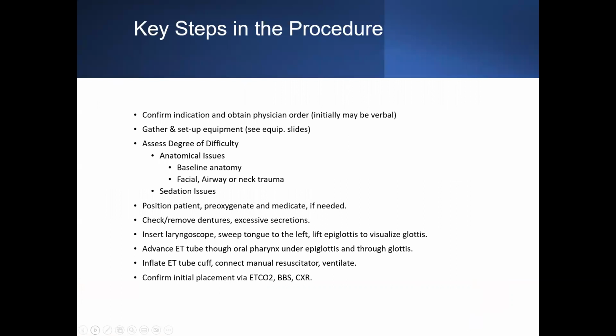Key steps in the procedure, you guys should be okay with this, even if you don't intubate where you work or where you have worked. Confirm the indication, gather and set up the equipment, see the equipment slides, assess the degree of difficulty. We'll talk about that momentarily. Consider things like sedation, position the patient, pre-oxygenate, medicate if needed.